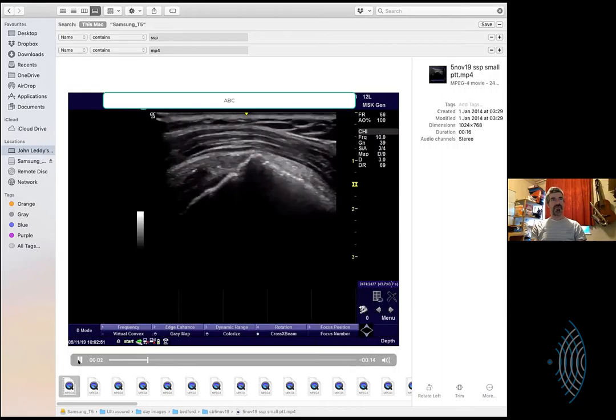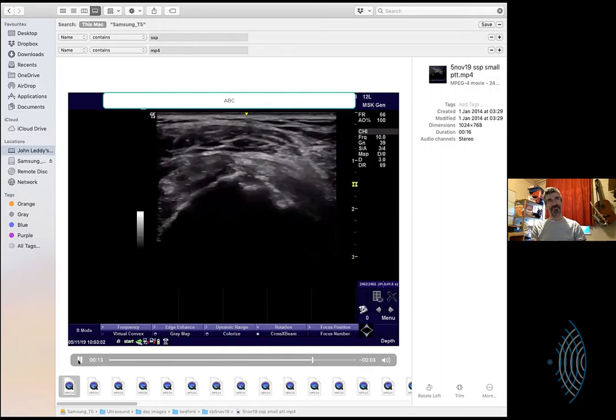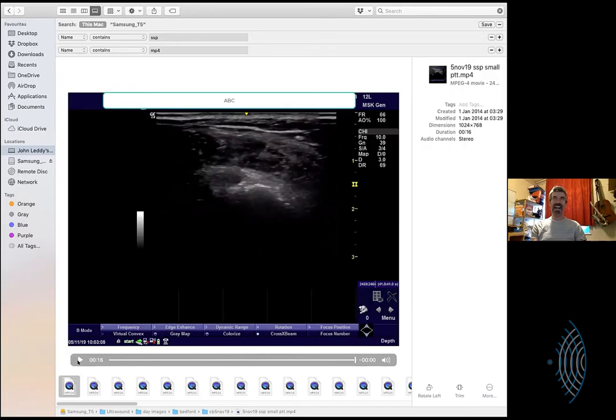The very first video that you had, when we first looked at it, had this almost like gravel. And are we saying that there is some avulsive force that is ripping up some of the calcific anchors within that? Or, and I know I asked you this before, and I'm seeing your face say, I think it's more of just a chemical response from inflammation. Yes?